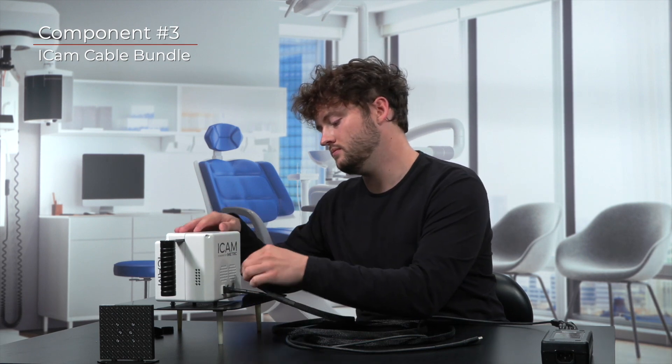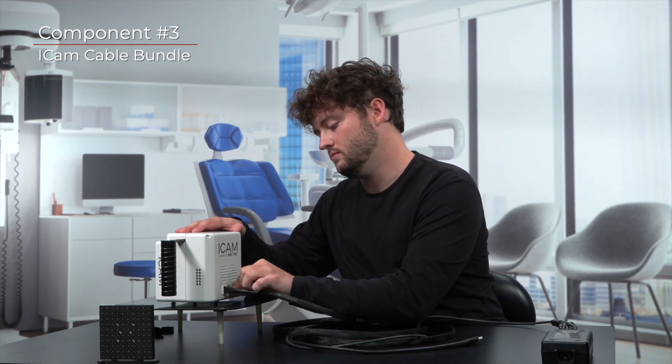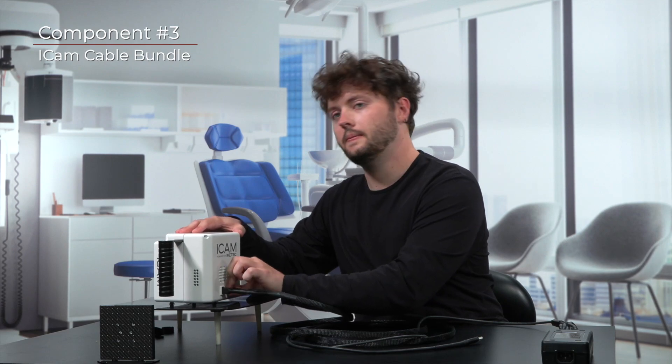Now let's connect the four-prong power by observing where the internal prongs are on the power connector. Take note of where the prongs can be inserted into the iCam. Once seated, you can then turn the circular connector clockwise to tighten the power connector to the camera. This will ensure that the cable's power connection is stable.